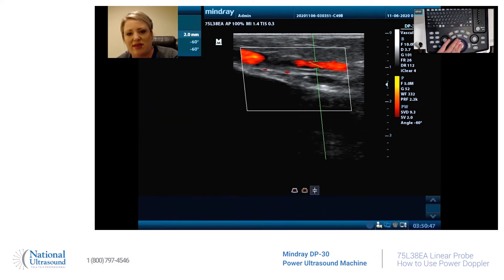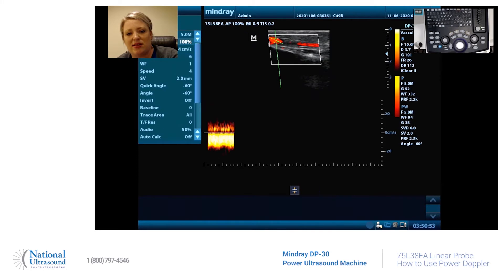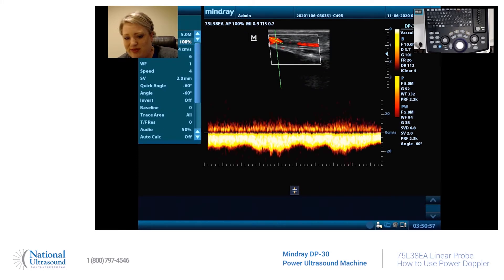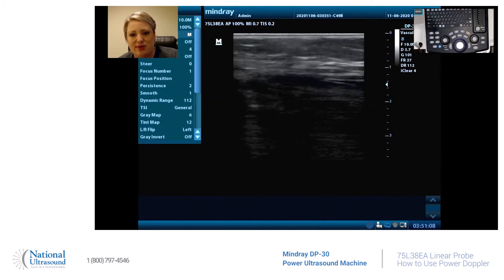Pulse wave — and update. So there's a vein getting perfect blood flow. We can see that there's not a blockage of blood in there. Now let's find the artery.